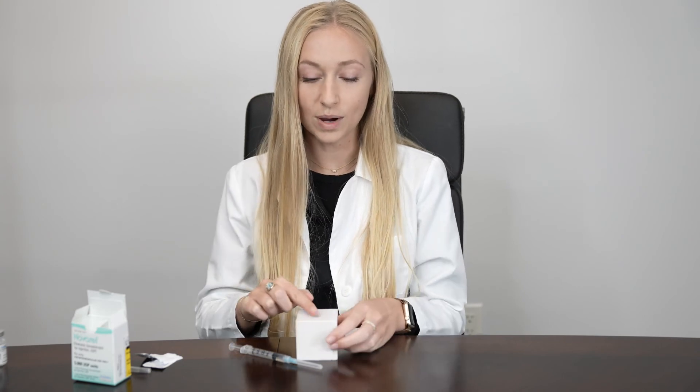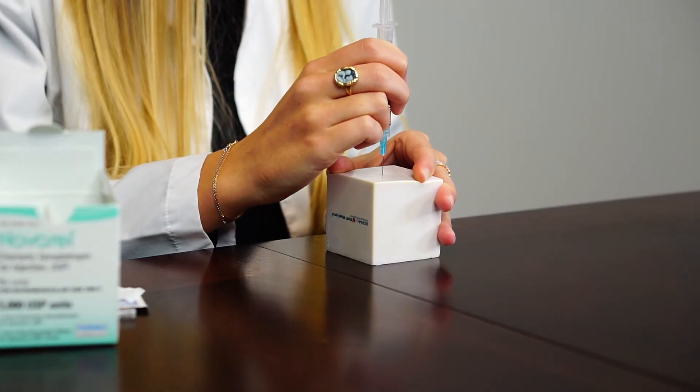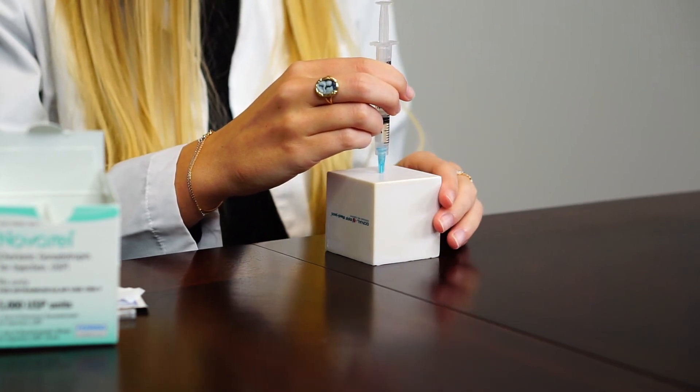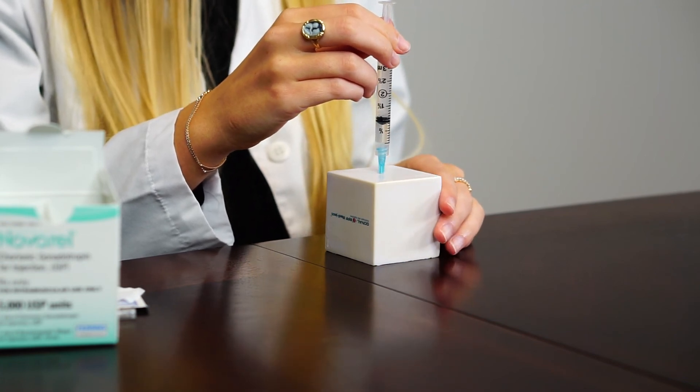Unlike your other injections, this will be an intramuscular injection in the upper outer quadrant of your buttocks. Wipe the skin with alcohol, spread the skin apart, and then inject at a 90 degree angle all the way down to the hub of the needle. The first thing you want to do is aspirate, which means to pull back on the plunger of the syringe. If you see a little air bubble or nothing at all, you're good to inject the medication.